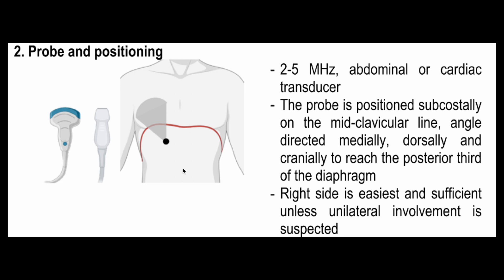Use the abdominal or cardiac probe at 2 to 5 MHz. The probe is positioned subcostally on the mid-clavicular line — below the ribs is the subcostal area. The angle is directed medially, dorsally, and cranially to reach the posterior third of the diaphragm. The right side is preferred since the liver provides a very good acoustic window.